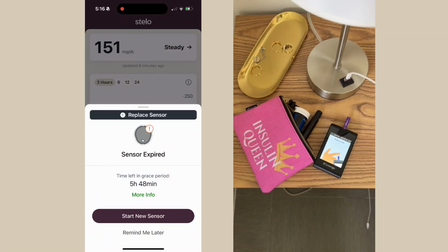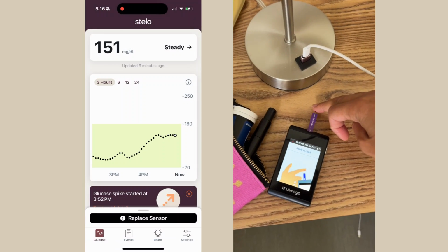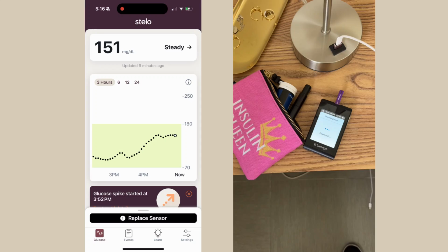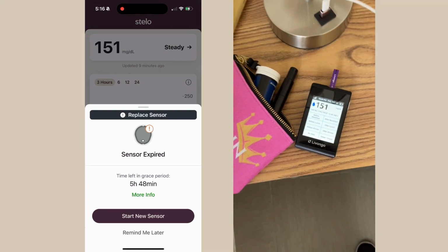But I was a little nervous about the accuracy towards the end of the sensor. My Dexcom G7s are only 10 days plus 12 hours, and they can sometimes be a little inaccurate towards the end. Dexcom Stelo is a 15-day sensor, plus that 12-hour grace period. But all good. Stelo performed extremely well, even towards the end of the sensor. You can see here, this sensor had less than 6 hours left of the grace period. Had it been inaccurate, there wouldn't be a whole lot I could do about it.